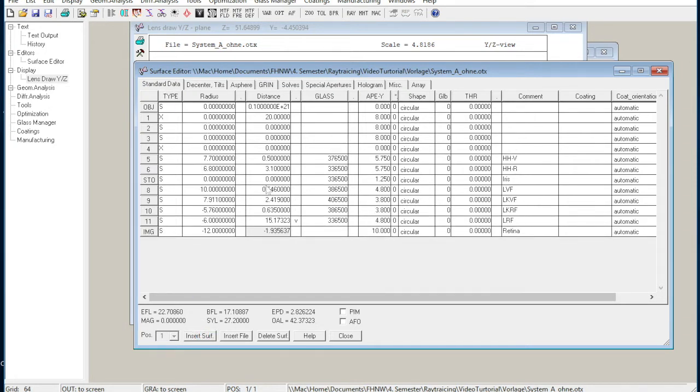We pre-calculated the data too. So we have 52 mm radius for the first surface, 90 for the second one, 5 mm for the thickness, and 12 mm for the distance between lens and eye. For the refractive index, we take 1.6, so we type 600/420. The diameter of the lens shall be 60 mm, so we type 30 and 30.